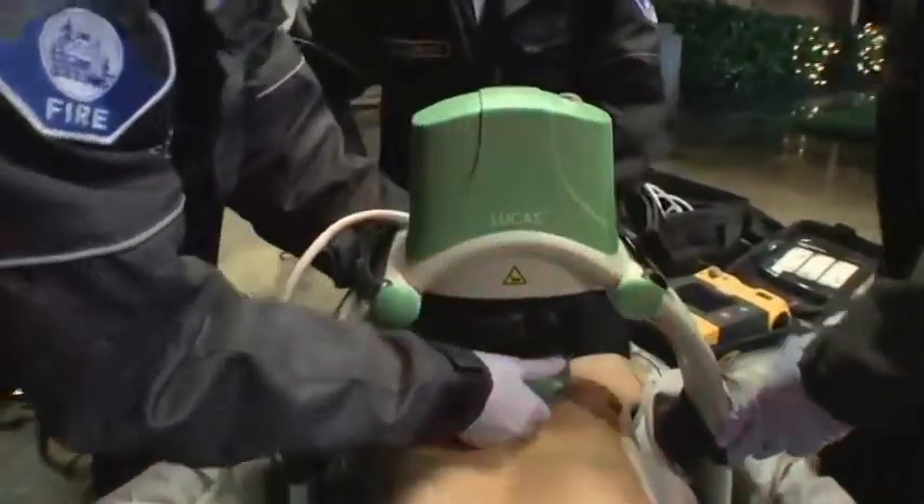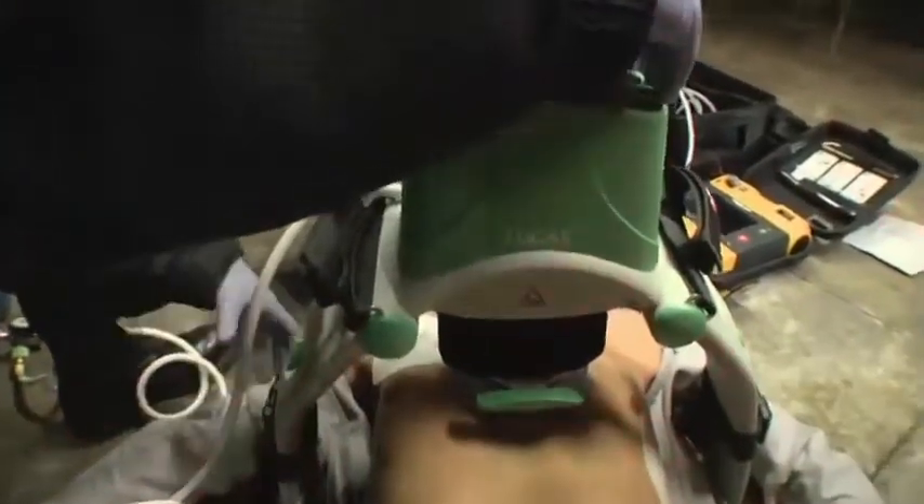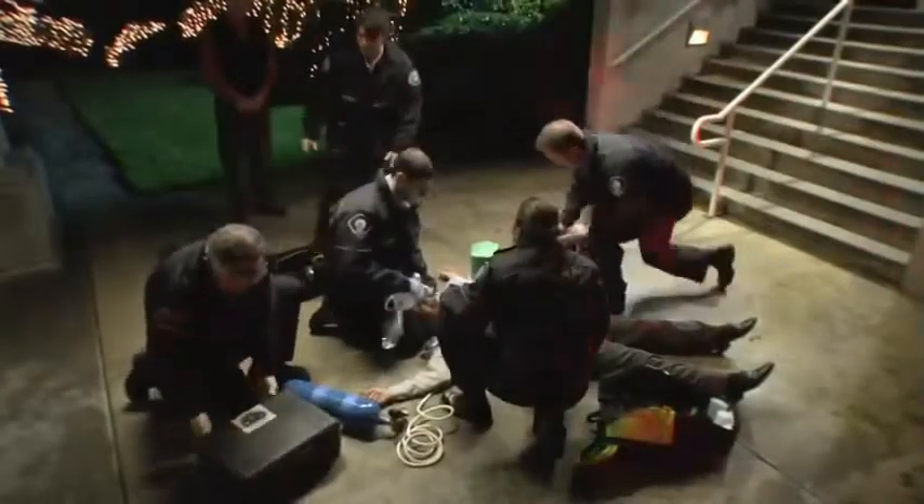In almost all situations, Lucas can provide effective, consistent, uninterrupted cardiac compressions in accordance with international guidelines. With Lucas providing compressions, rescuers have hands free for other life-saving care.